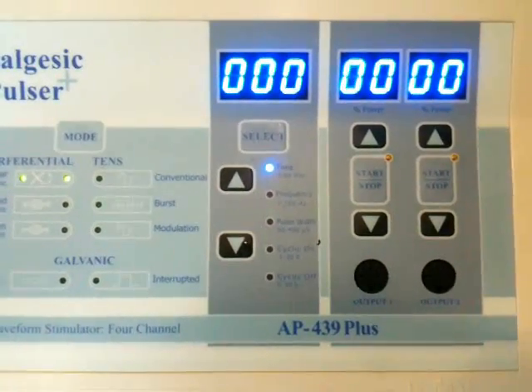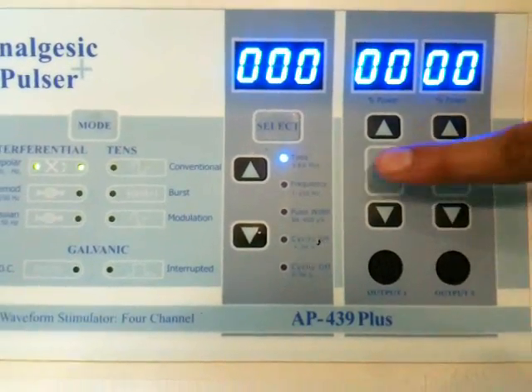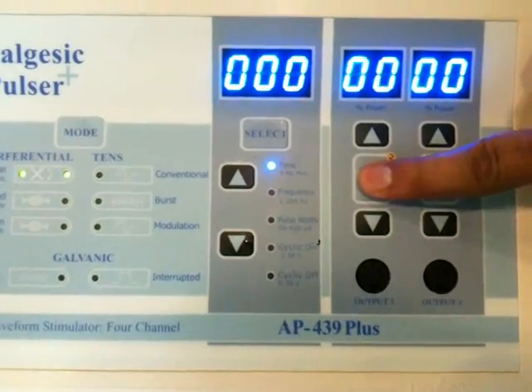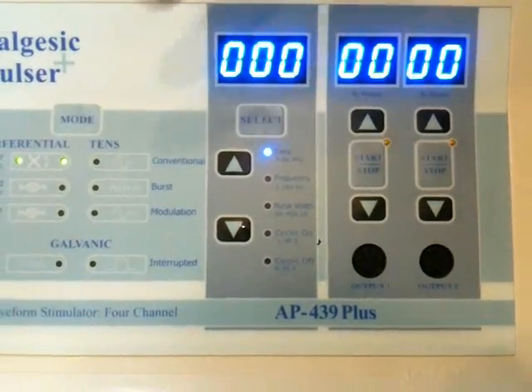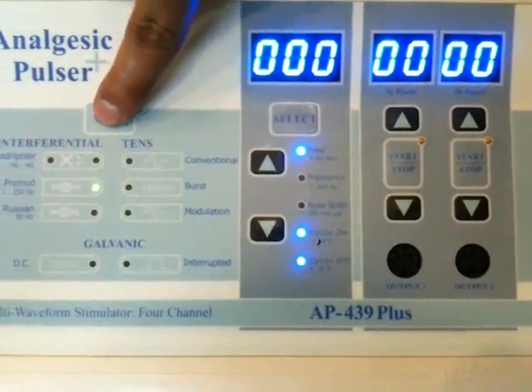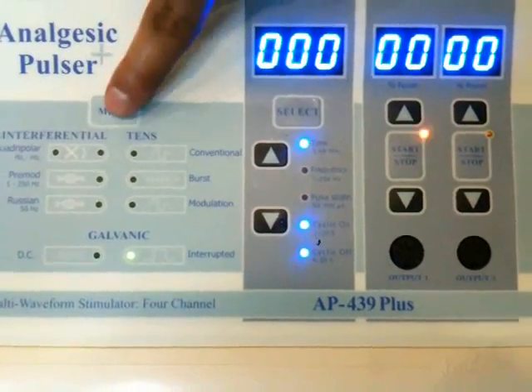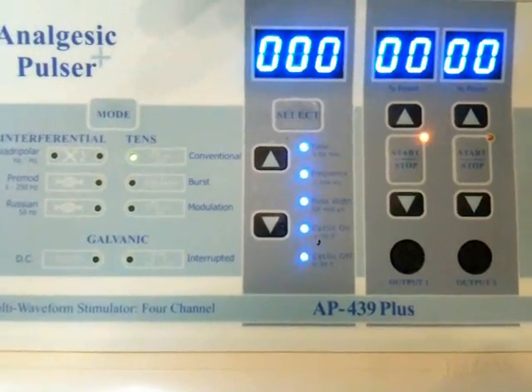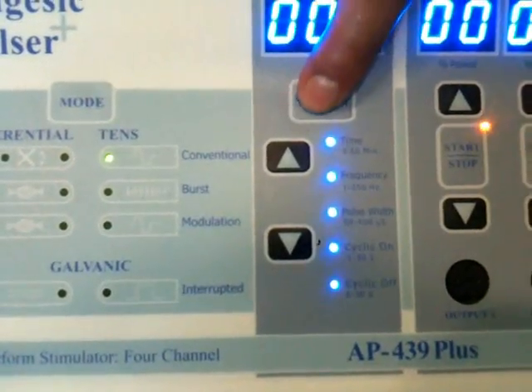Now selecting TENS mode. Starting channel 1. Selecting mode by pressing the mode keys — it's TENS conventional.